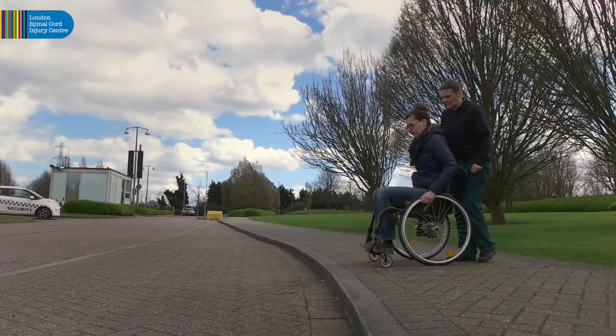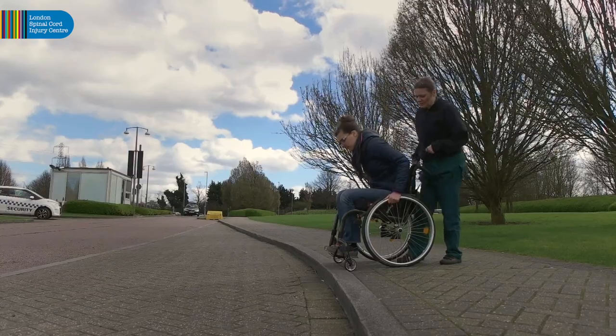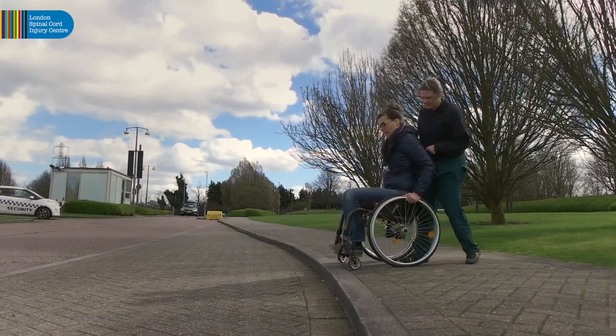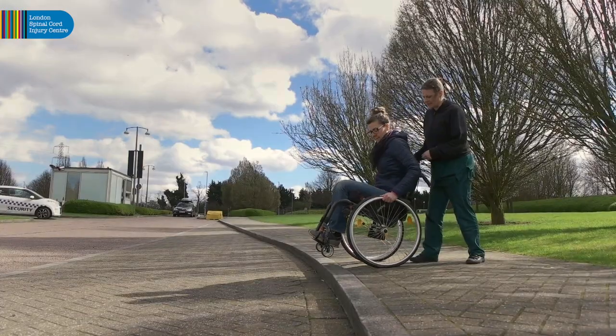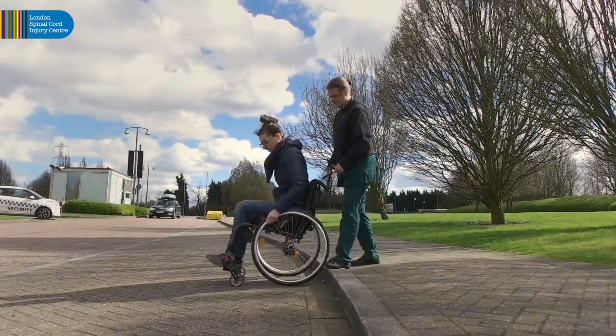If able to push into and maintain a back wheel balance with confidence, you can descend a kerb in this position. Approach the kerb edge, push into a back wheel balance and when stable, roll evenly off the kerb, then drop the front casters.